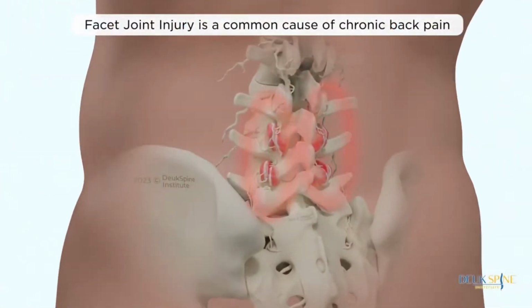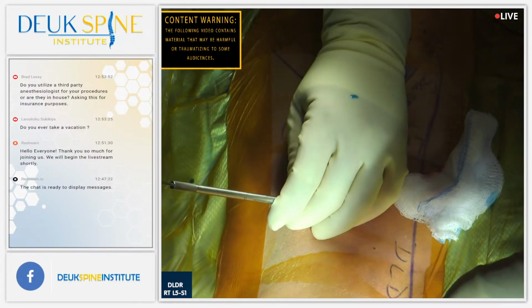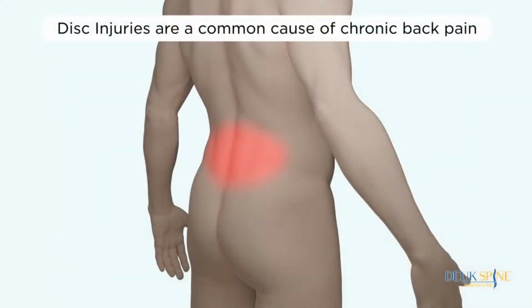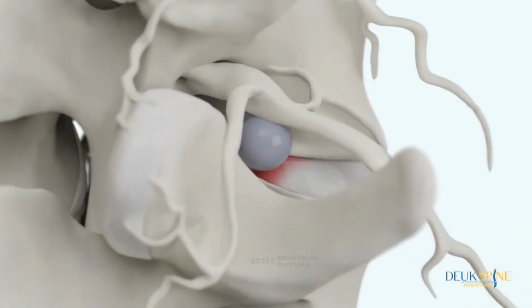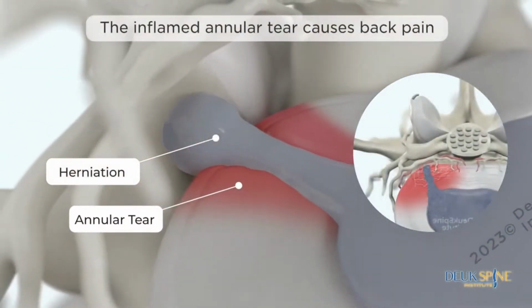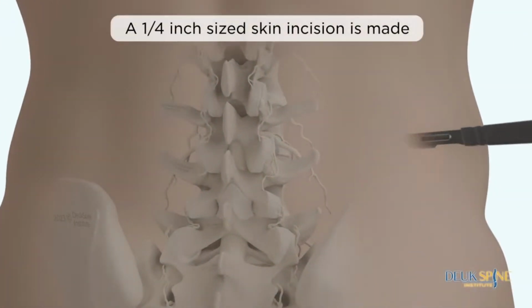Facet joint injury is a common cause of chronic back pain. Disc injuries are a common cause of chronic back pain. The inflamed annular tear causes back pain. A 1/4-inch sized skin incision is made.